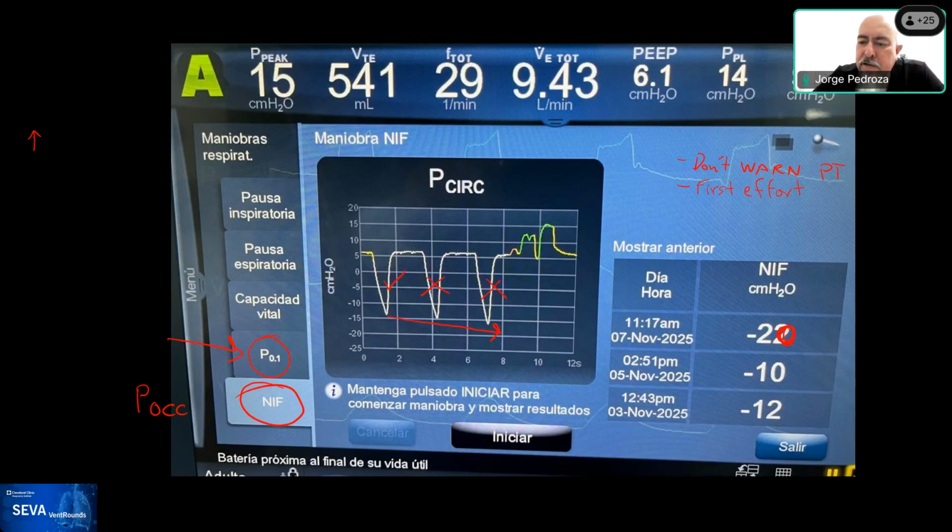And yeah, I agree with you, Ariel. It would have been nice to have all the measurements. Well, in general terms, I think an important thing here, Jorge, is, what do I do with this value?